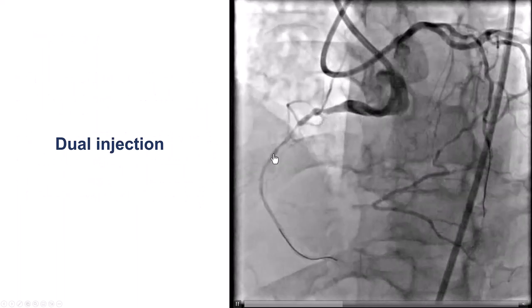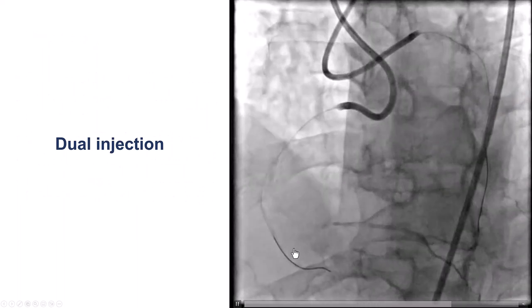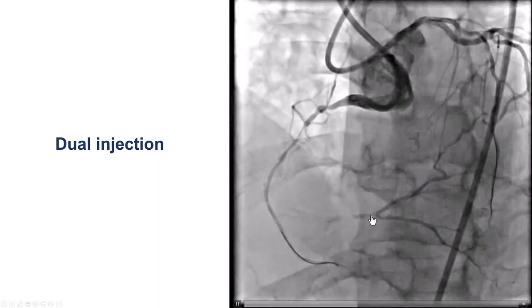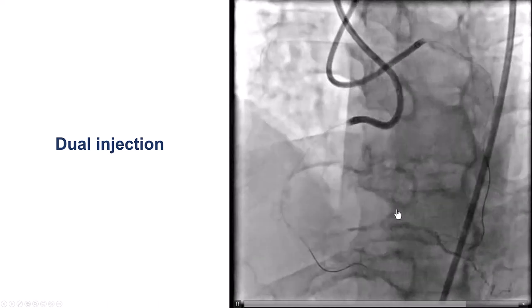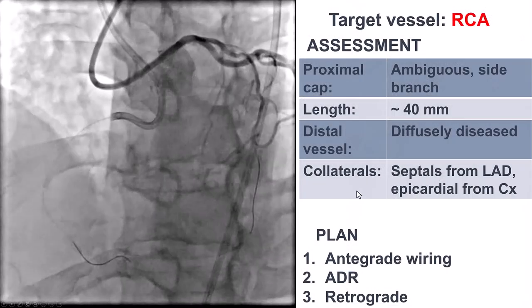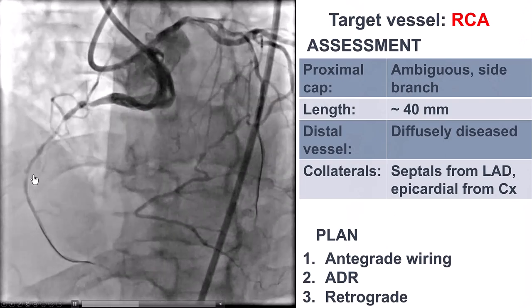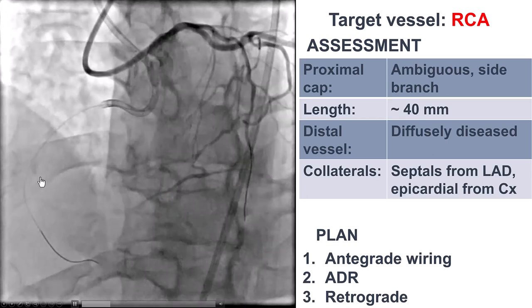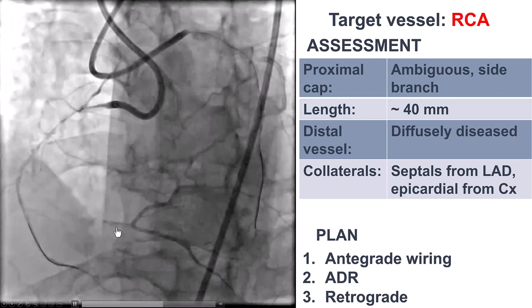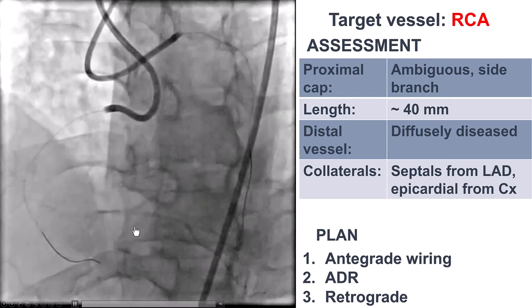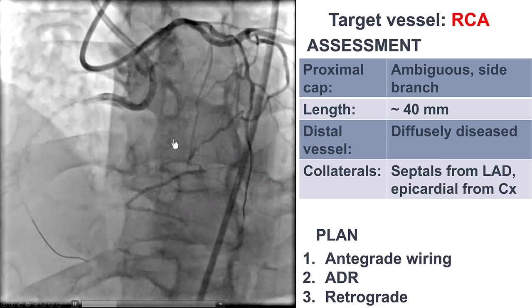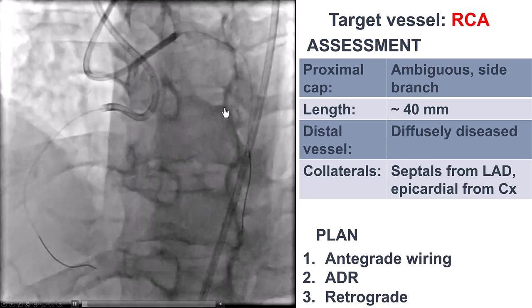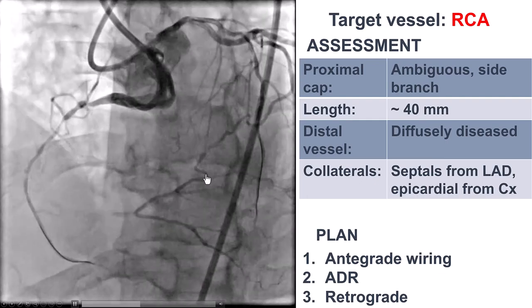This is the anatomy. We do have a CTO of the mid-RCA at the takeoff of a large acute marginal branch. There is diffuse disease and calcification on the distal RCA. There is a bifurcation of the PDA and a large right posterolateral. We have an ambiguous proximal cap at the takeoff of the acute marginal, length of about 40 millimeters, diffuse disease and calcification of the distal vessel, and the bifurcation of the PDA-PLV. There are some septal collaterals coming from the LAD, and also a large epicardial collateral coming from the circumflex.